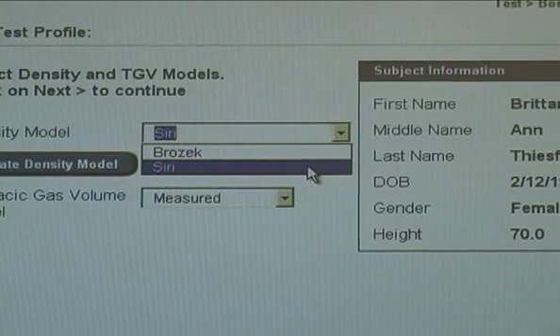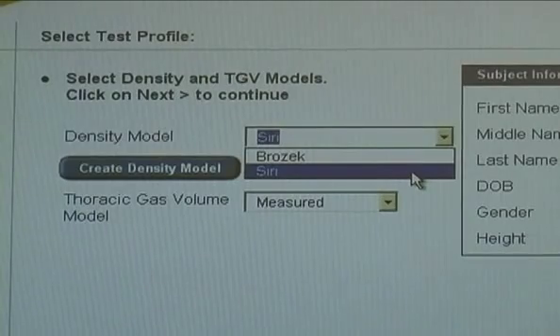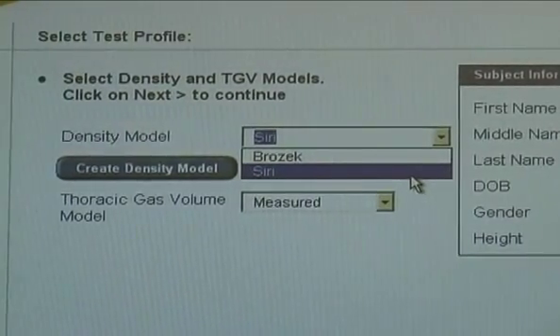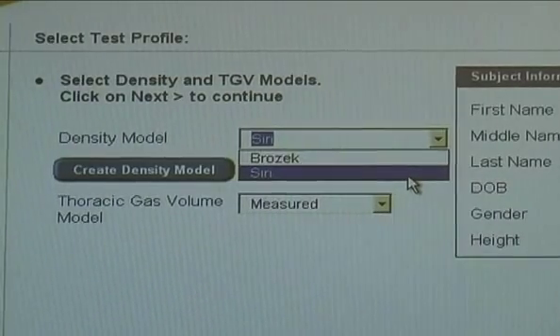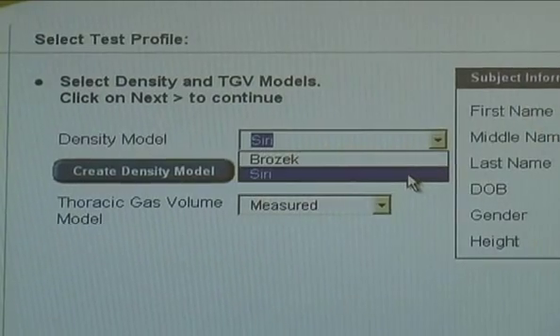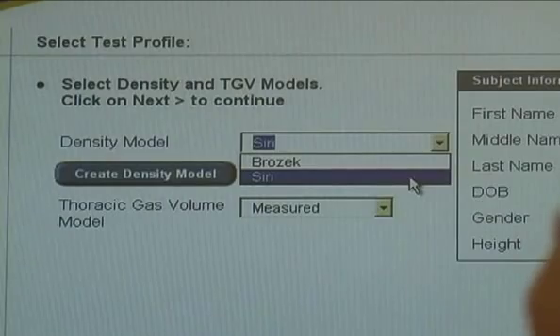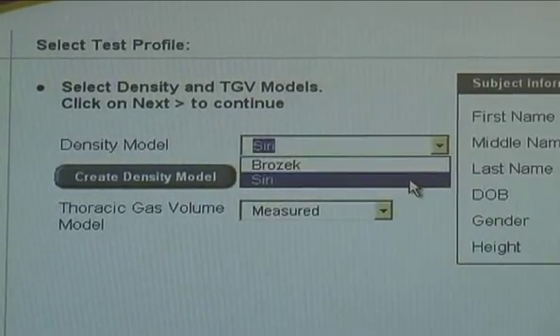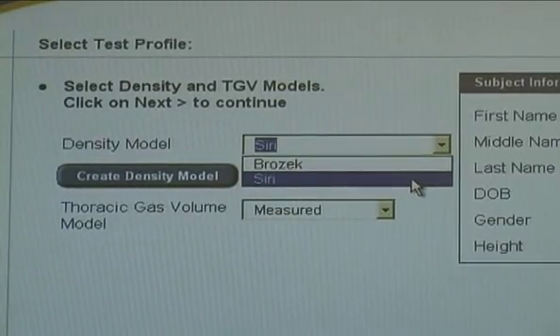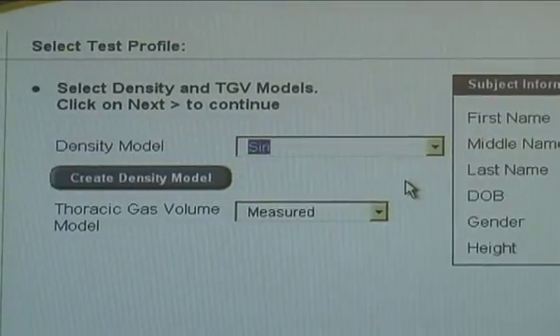That density model is typically used for athletic populations. So for example, at University of Florida, when they test the football team, for consistency purposes, because they have quite a dynamic with ethnicities, rather than changing back and forth, they use Brozak. So all the players are on Brozak, and subsequent tests are on Brozak. So you're not comparing individual A with one density model, and then the second and third test he had a totally different density model. So it defaults to Siri, so we'll leave it Siri.